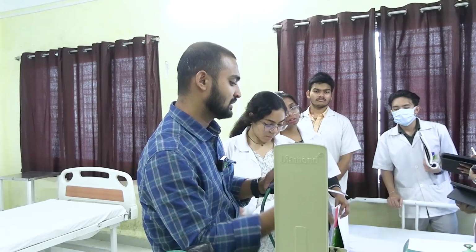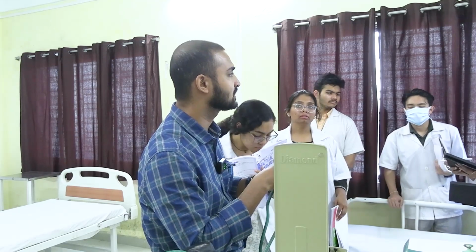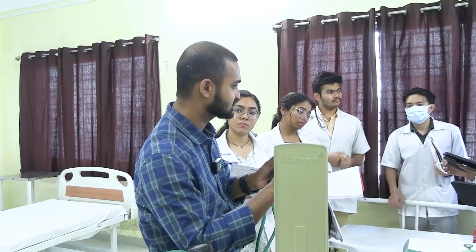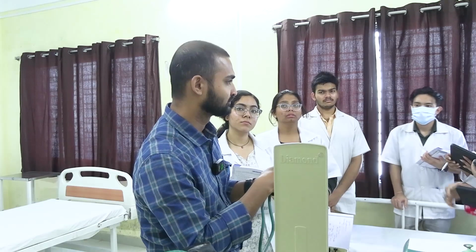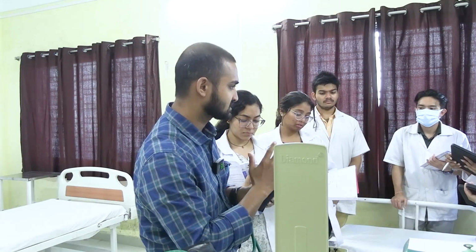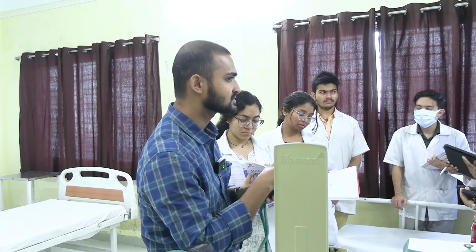So the ranges of the cuff measurement: in case of less than 1 year of age, it is around 2.5 centimeters. Then in case of 1 to 4 years, it is 5 centimeters, and in case of 8 years, it is around 8 centimeters. In adult it is 23 by 12.5 centimeters. Again, till 1 year it is 2.5 centimeters, till 4 years it is 5 centimeters, till 8 years it is 8 centimeters. So this is the range.